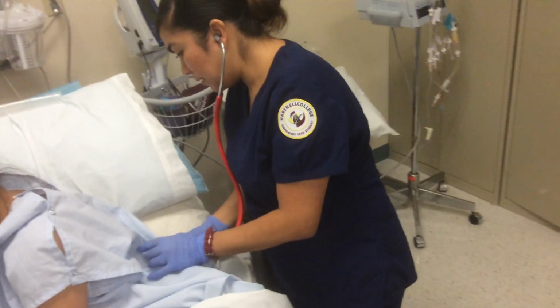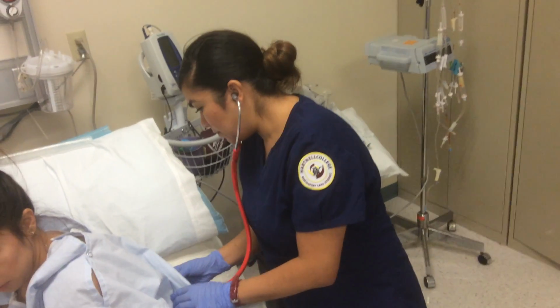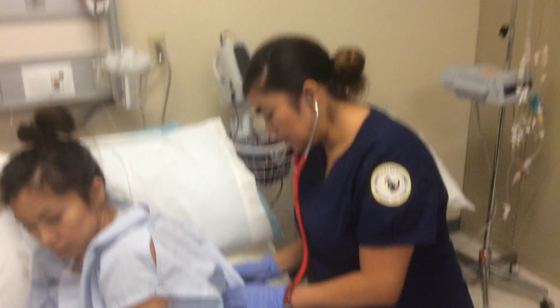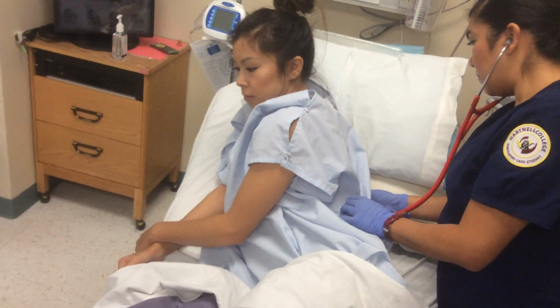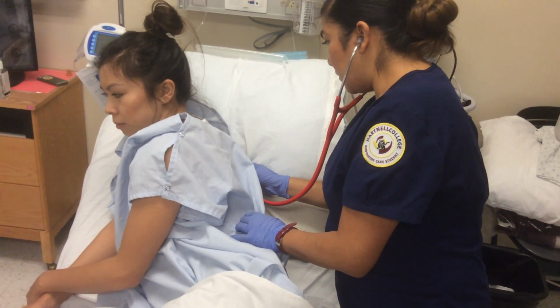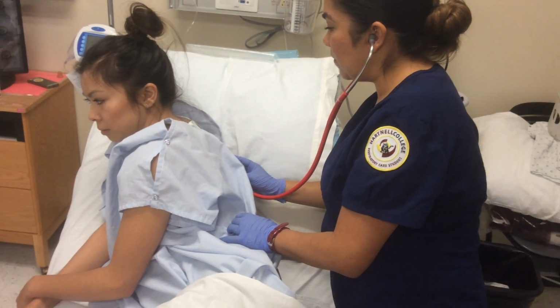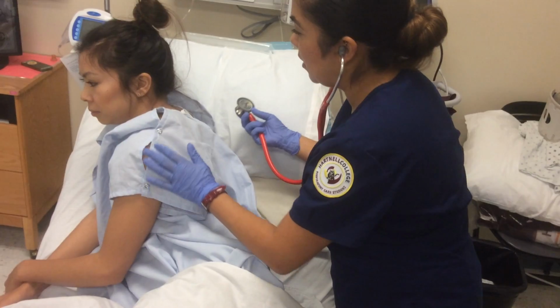Very good. And another one. Very good. Another one, please. Perfect. Very good. Another one. Are you feeling dizzy? No? Okay, thank you.